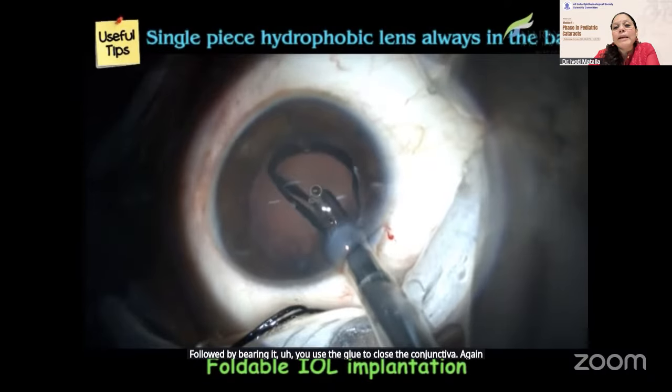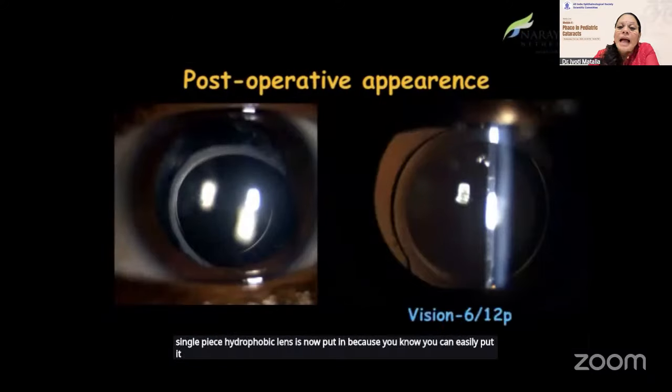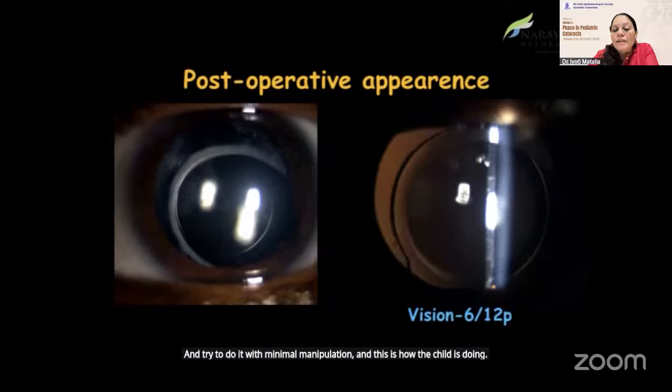Again, a single piece hydrophobic lens is now put in because you can easily put it within the bag, and try to do it with minimal manipulation. And this is how the child is doing after surgery, and is doing fine for the last 3 years.